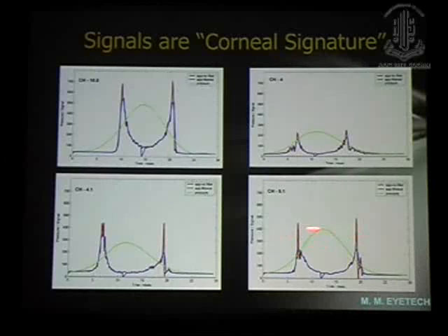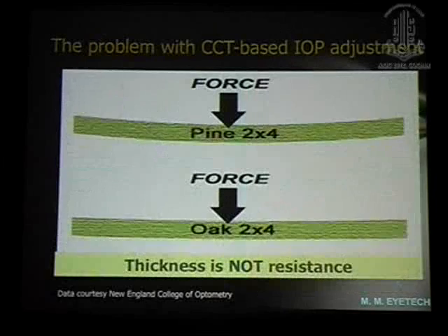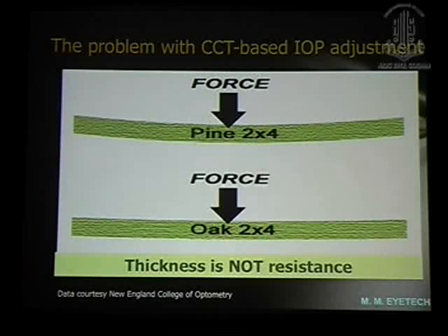Post LASIK, again the peaks move out. It follows pretty much a normal pattern, but it's just wider apart, with a drop in CH and CRF values. Now there are two or three parameters really which are important.